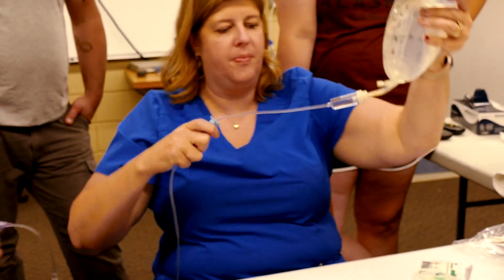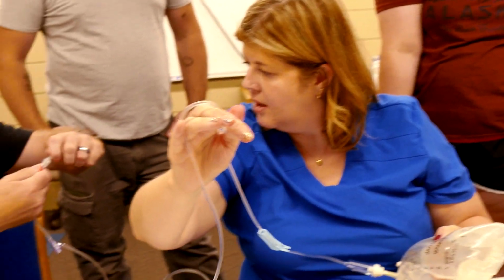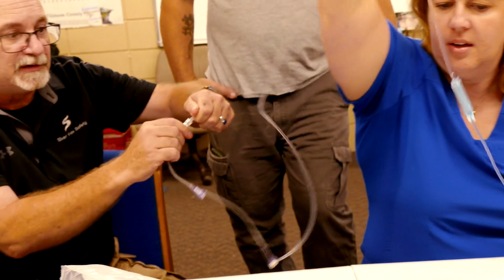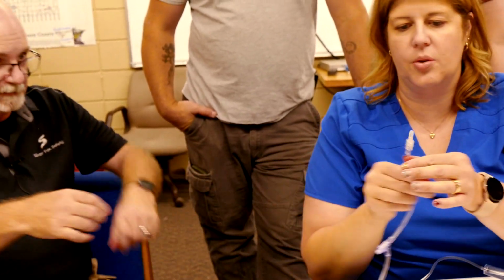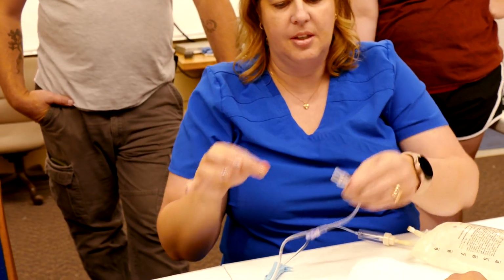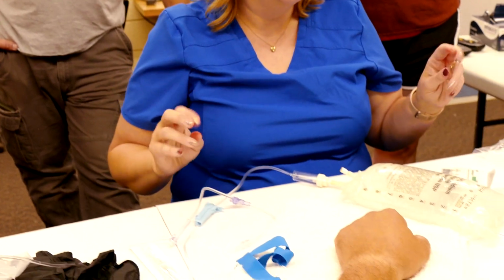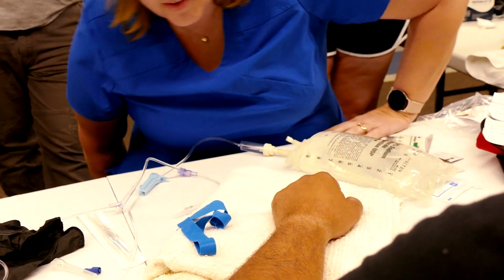Good. And there again, if you're single, I would loosen that and then put it back, just so it's barely on. Because otherwise, I'm going to do that. Yep. So just enough so it's on. Yep. Just to keep it clean. Yep. Now I can put my tourniquet on and then I'm going to go. Okay.